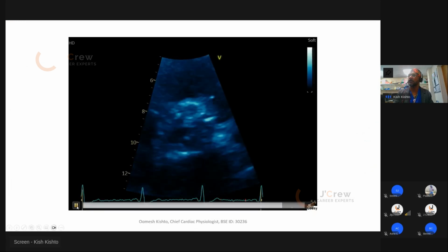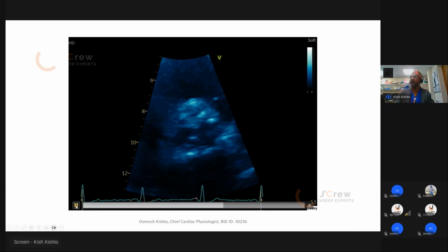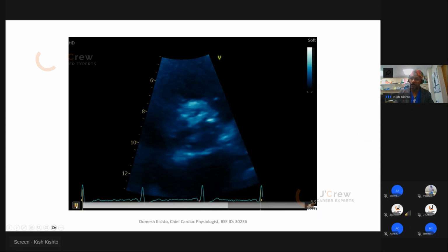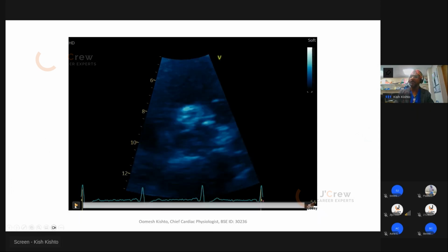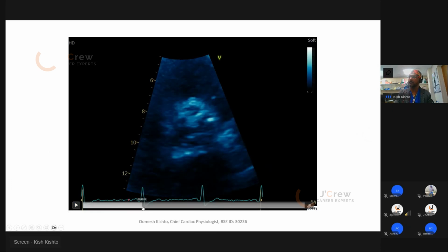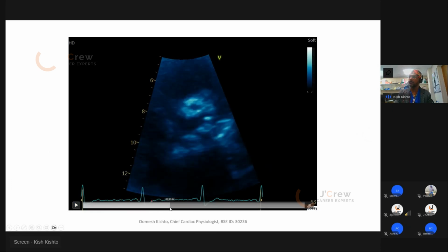Let's keep looking at this image, okay? And I personally think it's tricuspid. Let's look at this.